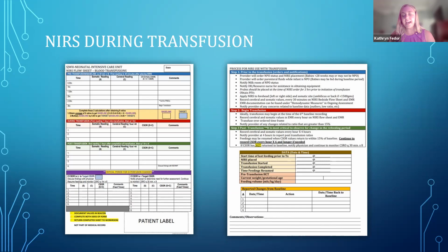So a lot of these infants were still a little bit up and down on their SATs and a little back and forth on their oxygen, maybe not the most stable babies in the unit. So I did encourage nurses, if the baby's satting 70 at one point, not to record that NIRS value, but rather try to always record a value where the baby's satting in an appropriate range, so that we had some continuity of our readings.